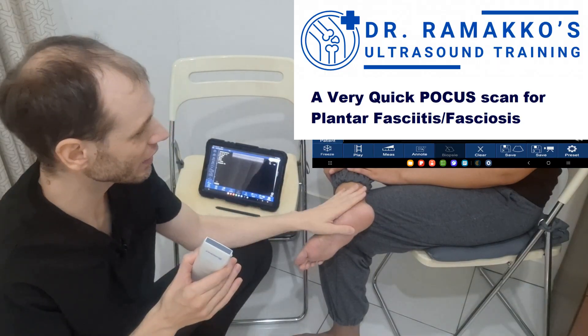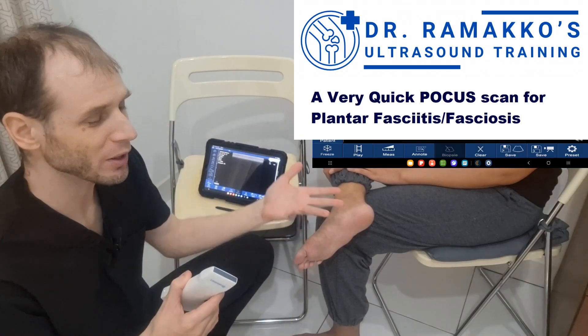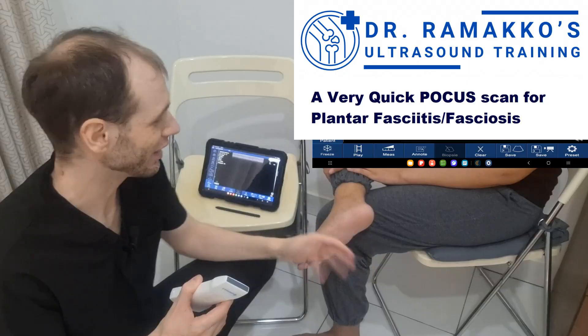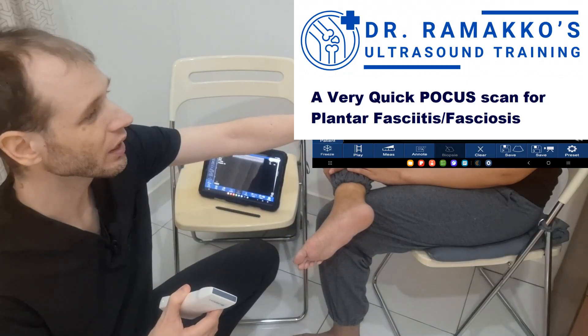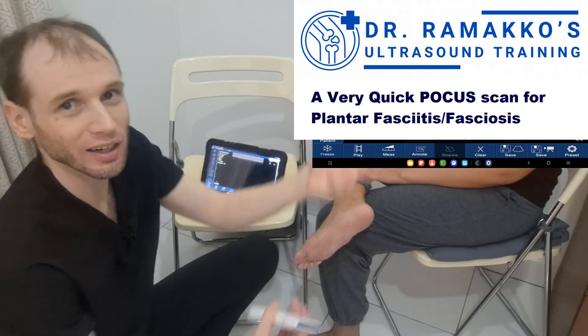Our sample patient here shows one possible patient positioning, but you can pretty much use almost any position that gives you access to the foot. If you have a taller table where they're sitting and their foot is dangling, just place the probe underneath and check.